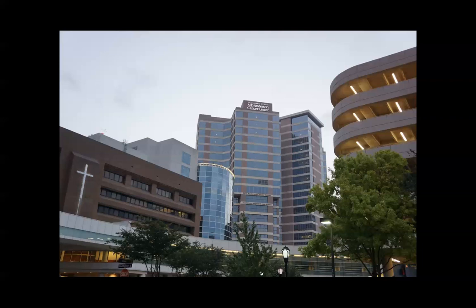Thank you. One problem that I'm actually facing: when you have an excellent colon prep, like a Boston Bowel Prep scale of 9 and no bubbles, and you have the latest series of scopes with near focus function and others, and you examine with your scope close to the wall, not in the center of the lumen, but in a circular motion close to the wall with a cap-fitted scope, the number of times I find something additional when I do a chromoendoscopy is very small.